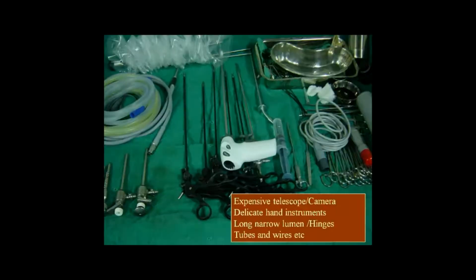Next slide. If you see this picture, when we do laparoscopic surgery, we use a variety of equipment: expensive telescopes and cameras, and delicate hand instruments, especially instruments with long narrow lumens, hinges, tubes and wires. So we can't put them all together in an autoclave. Some are delicate, some may not be suitable for autoclaving. So one has to have a definite plan to sterilize each and every piece of equipment during laparoscopic surgery.